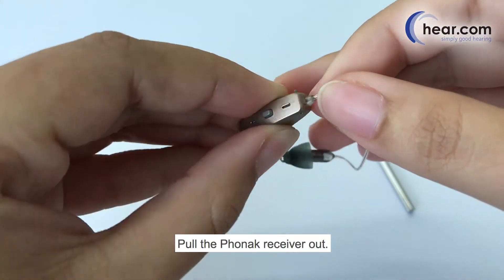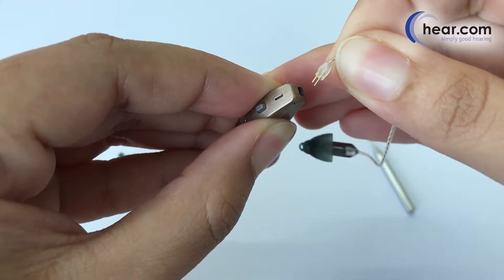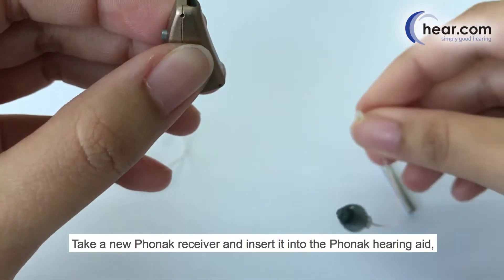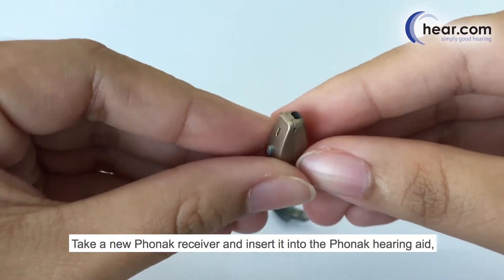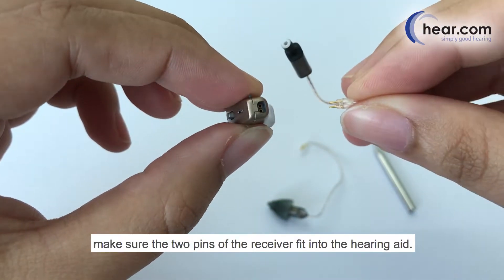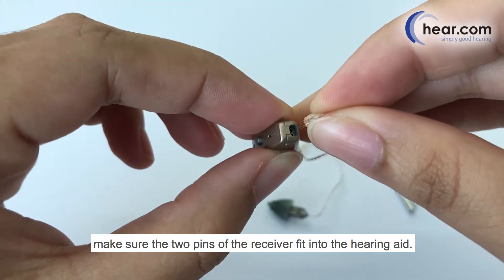Pull the Phonak receiver out. Take a new Phonak receiver and insert it into the Phonak hearing aid. Make sure the two pins of the receiver fit into the hearing aid.